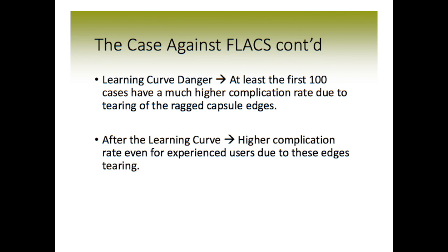What studies have shown is that there's a learning curve danger. For surgeons learning this technique, at least the first 100 cases have a much higher complication rate due to tearing at the site of those ragged edges. And even after the learning curve, studies have shown a significantly higher complication rate even for experienced users due to these edges tearing.